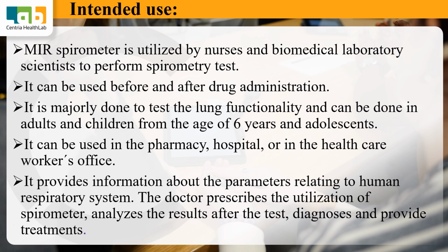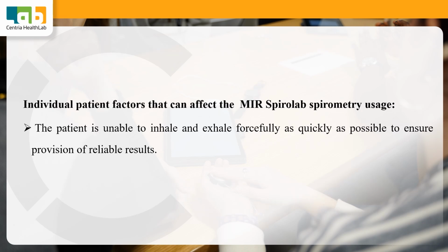It provides information about the parameters relating to the human respiratory system. The doctor prescribes the utilization of a spirometer, analyzes the results after the test, diagnoses, and provides treatments. Individual patient factors can affect this Spirolab spirometry usage. The patient may be unable to inhale and exhale forcefully as quickly as possible to ensure provision of reliable results.